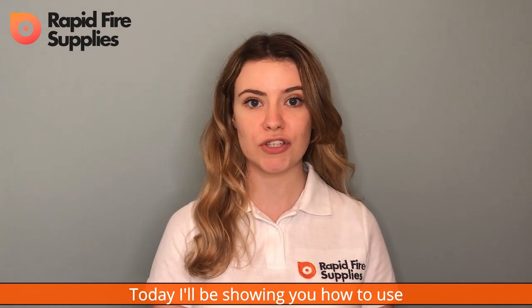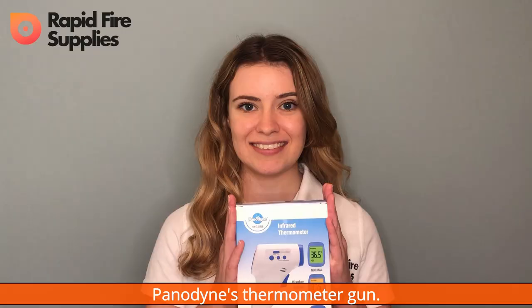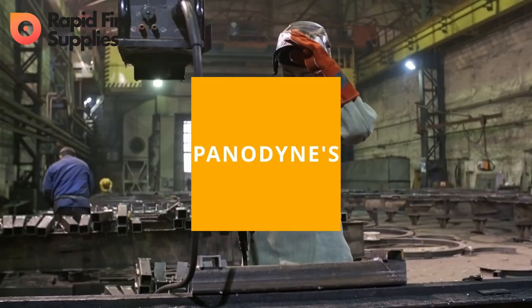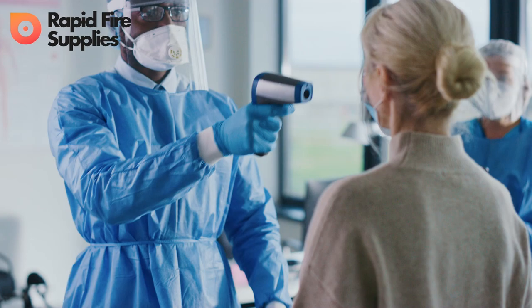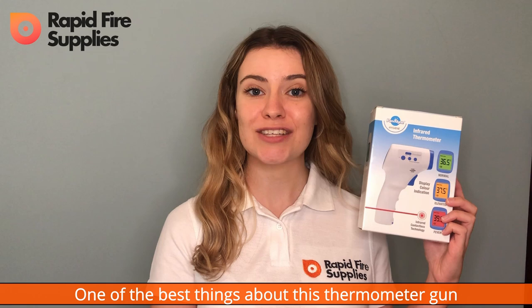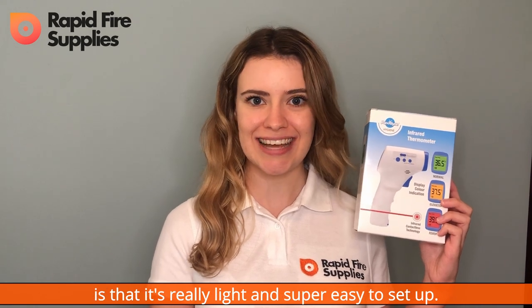Hi, I'm Emily from Rapid Fire Supplies. Today, I'll be showing you how to use Panodyne's thermometer gun. One of the best things about this thermometer gun is that it's really light and super easy to set up.